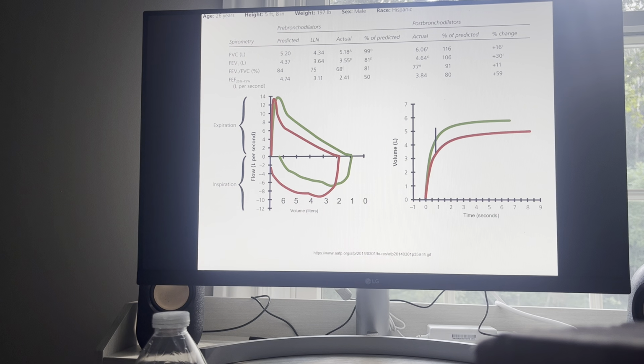So let's go back to this. Let's do pre-bronchodilator. We established the patient's residual volume is 2. What is the patient's total lung capacity? How much air can the patient's lungs theoretically hold? It's right about 7. So what is the patient's forced vital capacity? 7 minus 2 is 5. But in actuality, spirometry cannot determine the residual volume or the total lung capacity. You would need to refer to pulmonary specialty for the lung volume test for that.